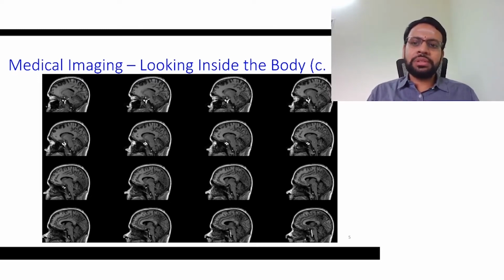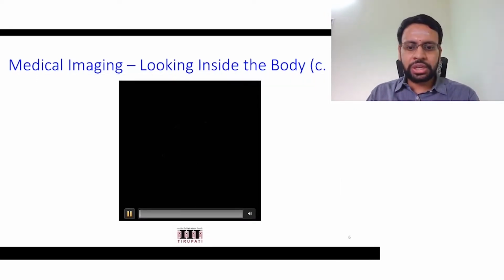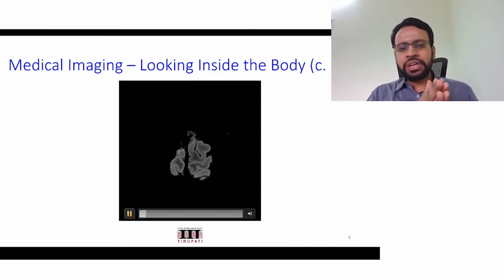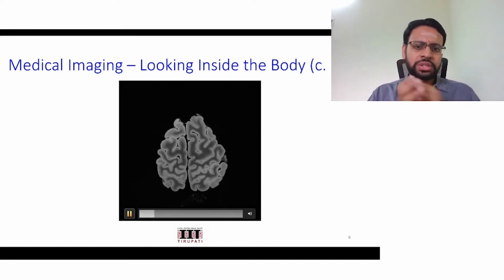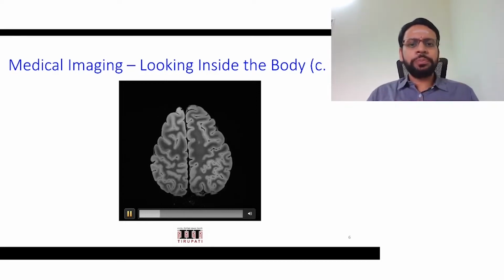Say, for example, this is the magnetic resonance image, also known as MR imaging, and let me play a video of it meanwhile while discussing that. So this is, I guess, done at 100 microns level. You could get the precision using MR imaging, which is non-invasive. This is done by Massachusetts General Hospital, MGH.